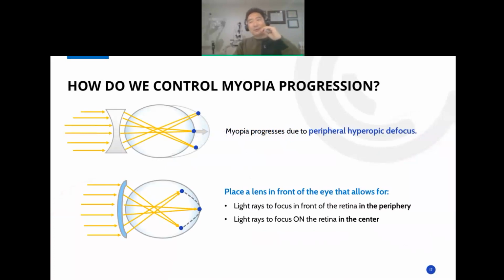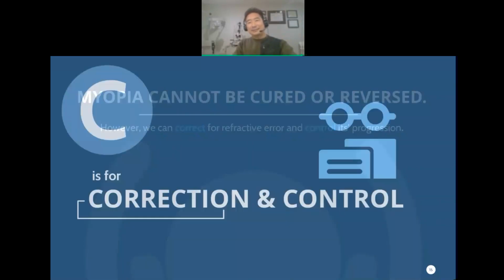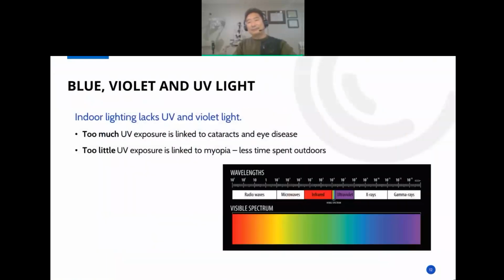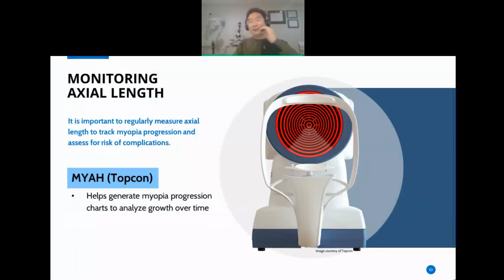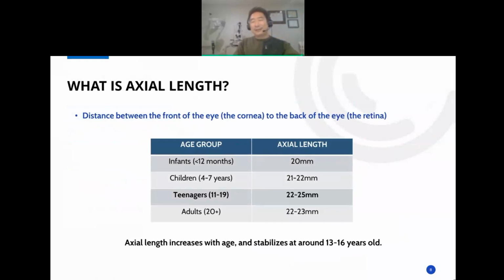They're going to come up with new papers. Hopefully there'll be some sort of calculator where you plug in your axial length for your age and ethnicity, and it will tell you if you're within normal range or not. So for now, take that slide with a grain of salt. If you know someone's outside that range, just be aware of it. Maybe you want to treat a little more aggressively. If you're on ortho-K, then you might want to add atropine. Again, this is just a ballpark.